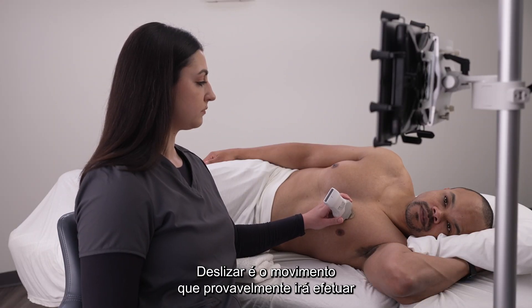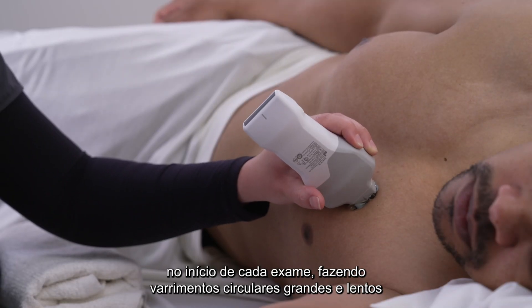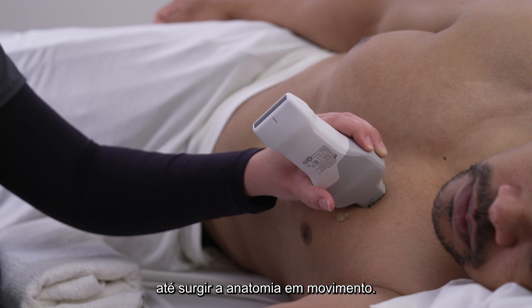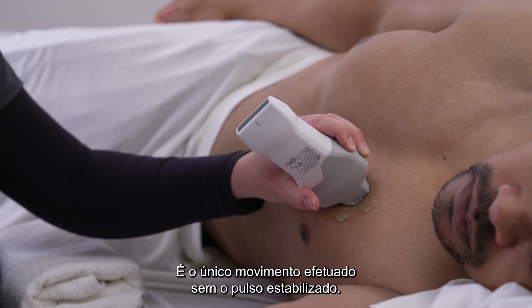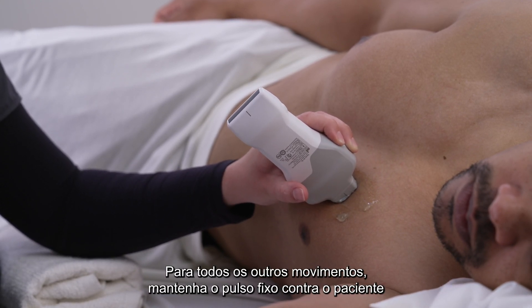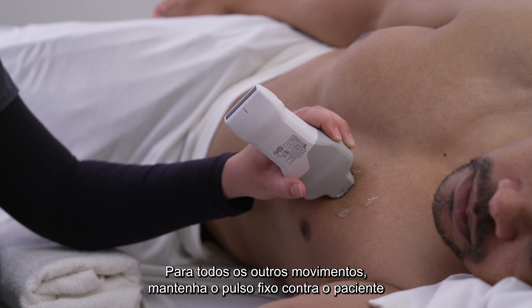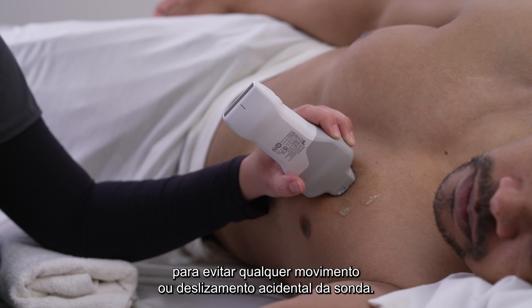Sliding is the movement you will likely perform at the beginning of every scan, making large, slow, circular sweeps until moving anatomy appears. It is the only movement performed without your wrist stabilized. For all other movements, you want your wrist secure against the patient to prevent any accidental probe movement or slipping.